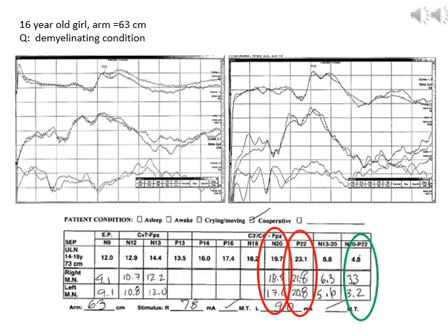And then the second interpeak latency value that we're interested in is the value between the N20 and the P22. And so you'll see that the N20 value is subtracted from the P22, giving us the travel time between the first cortical generator of the N20 and then the generator of the P22. And so that tells us about intracortical conduction, the travel time within the cortex.